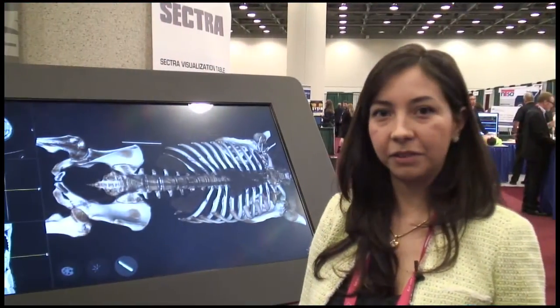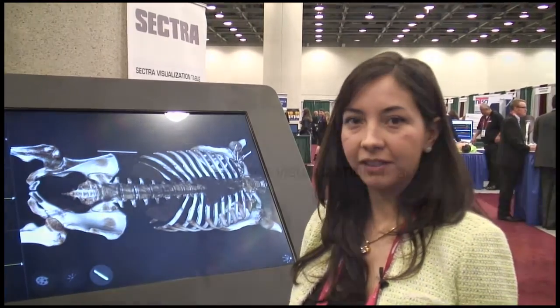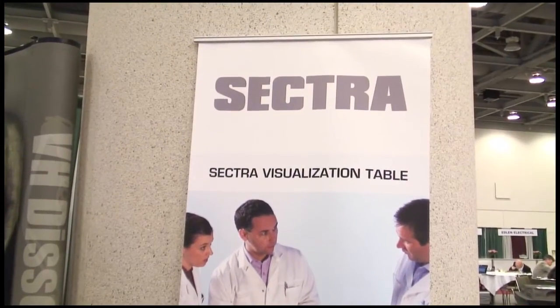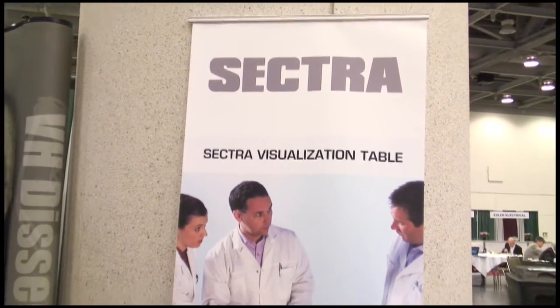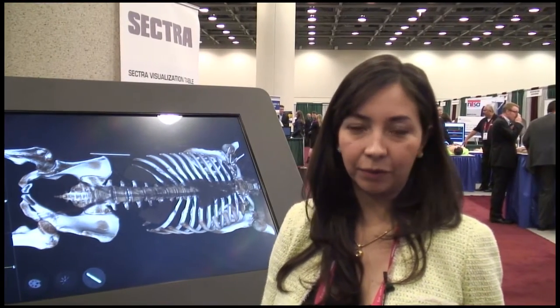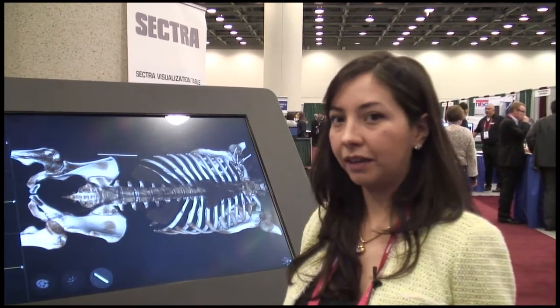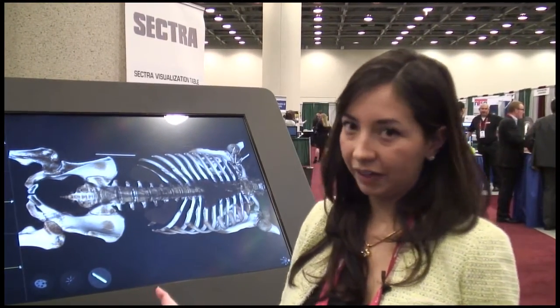I'm Carla Ramirez, I'm from Sectra. This is the Sectra visualization table. Sectra is a Swedish company that has been in the market for more than 25 years and our main product is the PACS, which is a radiology system to communicate with different modalities. Now we are passing that expertise in radiology to the medical field, to education.